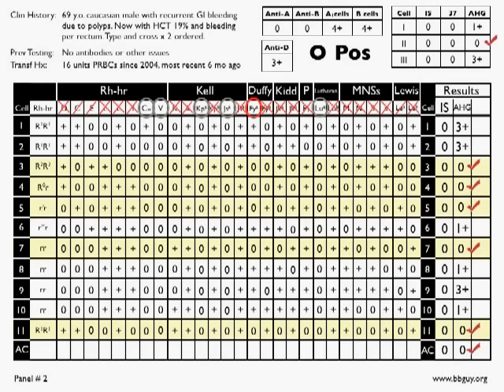So now we take a look at Duffy A and we see if that matches our positive reactions. So let's see if it does. We've got 3+ reactions in cells 1, 2, and 9. What do we have for Duffy A in 1, 2, and 9? I'm sorry, and we also have 1+ reactions in 6, 8, and 10. So does that match up? Well, for Duffy A in 1, 2, and 9, we have a double dose expression of Duffy A. That corresponds to the strongest reactions.